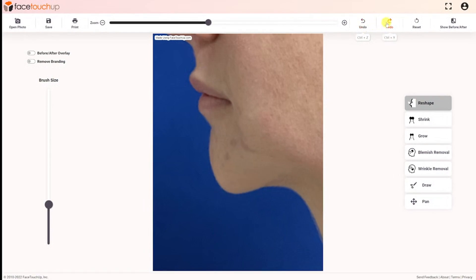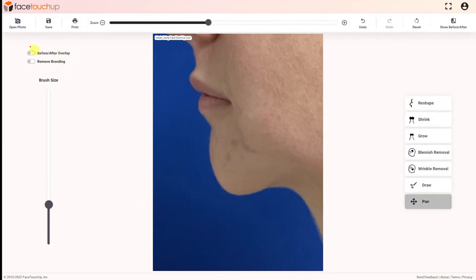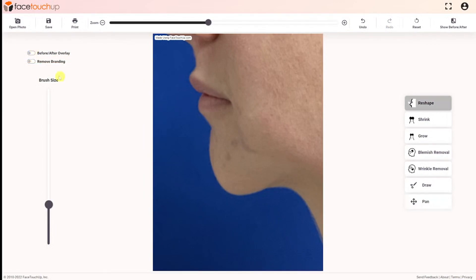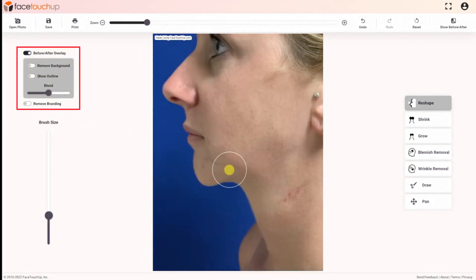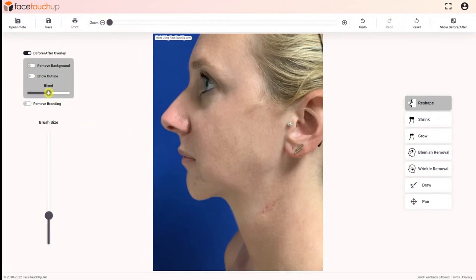Doctors who have a subscription to the commercial license also have access to the overlay feature, a tool specially made for plastic surgeons. This feature is enabled by toggling the tool. Toggling the remove background and show outline options shows the changes a patient can expect. Use the blend slider to show the changes to the patient.